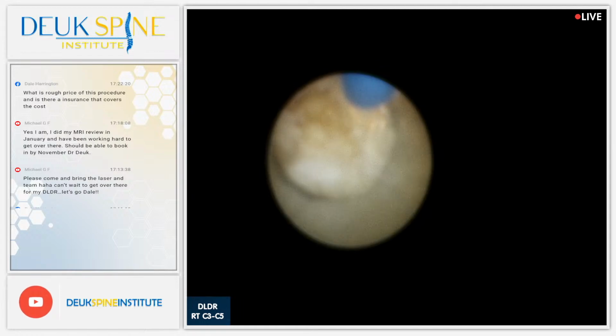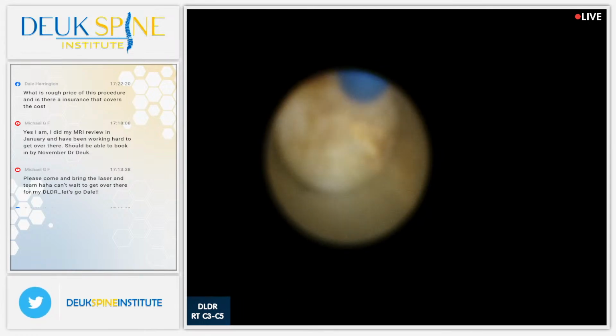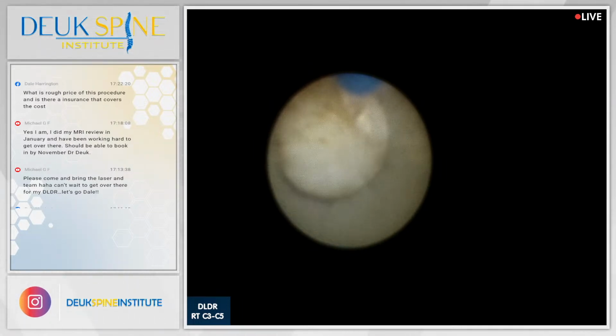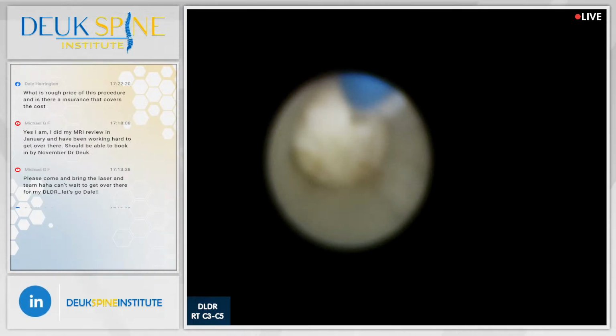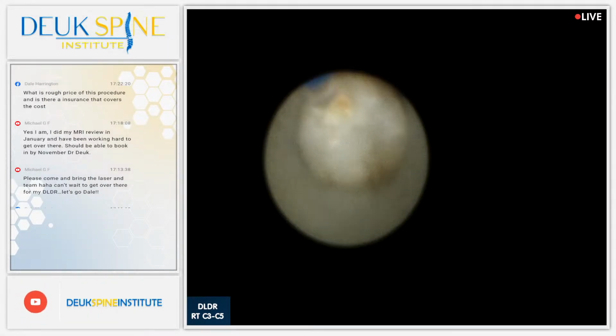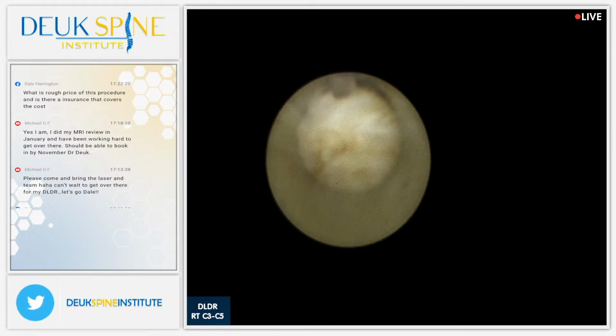A herniation does a lot of its damage by pressure on surrounding structures: spinal cord, nerve roots. By getting some of the mass from the herniation out of there with the laser or grabbers, surgical tools, you can reduce the amount of pressure effect it has on the nerves and spinal cord, and that's really what we're doing here. That's all we can do. Why can't I get more lateral?